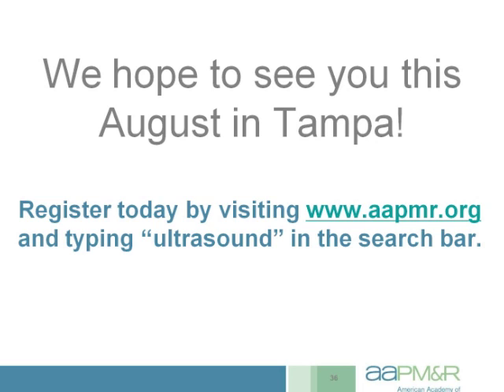And sometimes I also find that helpful from a diagnostic perspective. For example, if a patient has medial scapular pain, there are several muscle layers there, and oftentimes I can actually see the twitch response to a particular muscle layer under ultrasound as I see the needle engage that layer, and oftentimes the patient will give me feedback saying, yes, that feels like you're exactly at the spot of my pain. And of course there are multiple muscle layers in the cervical spine as well.